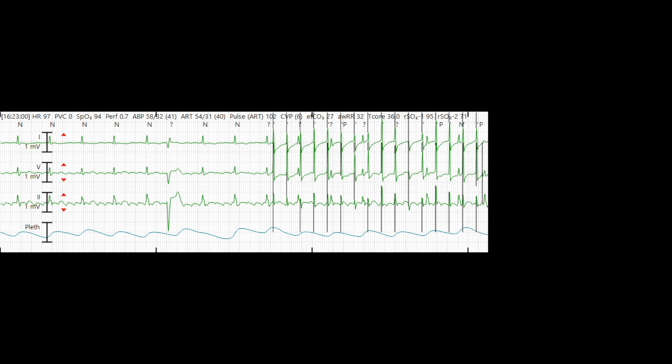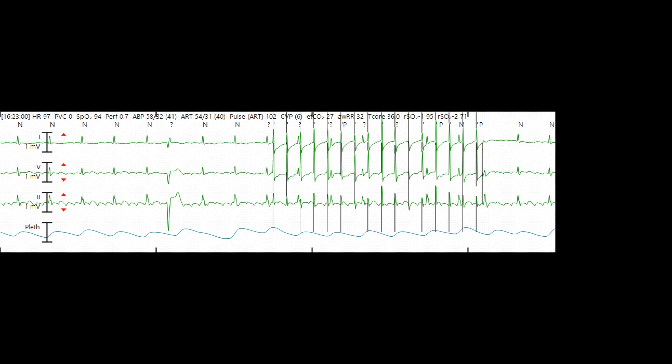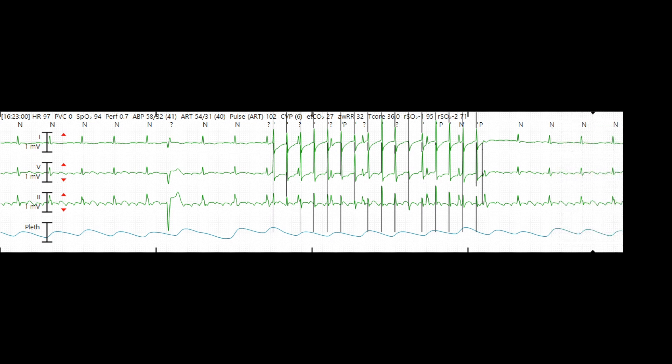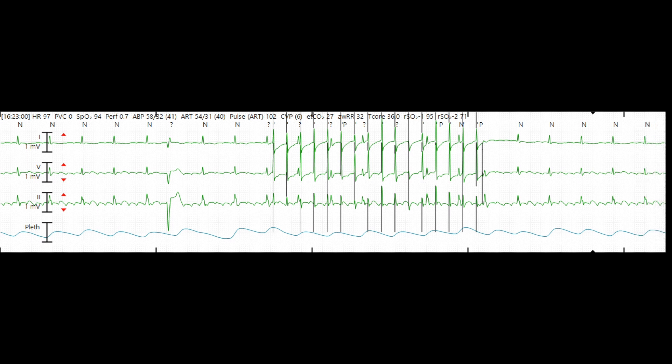Even if the patient didn't have heart block, rapid atrial pacing shouldn't result in rapid ventricular rate, since the AV node can't conduct from the atria to the ventricles that fast. Since the rapid atrial pacing rate was slower than the atrial flutter rate, the arrhythmia is not terminated and continues after the pacing.